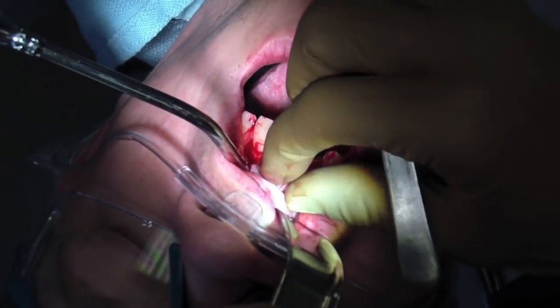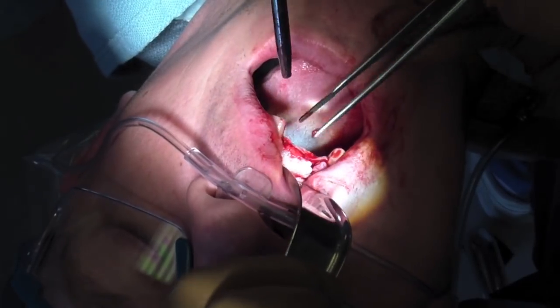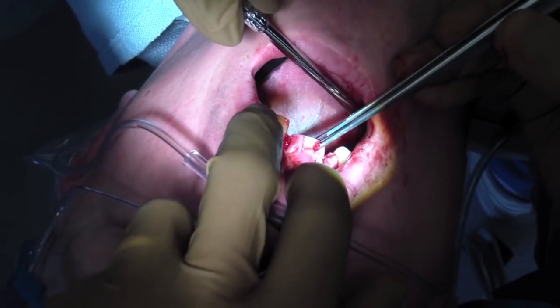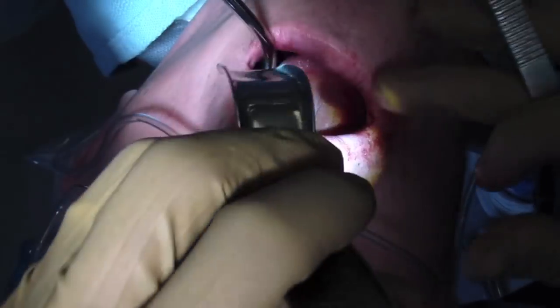The best way I can describe it: if you put a whole bunch of stuff under carpet and try to hide it — like say a couple books — and try to stretch the carpet over, it's not going to happen unless something gives. So that's what's happening in this case. What we're doing here is I'm just checking to make sure I get enough movement of that flap.